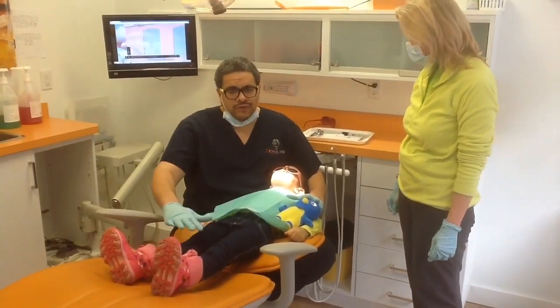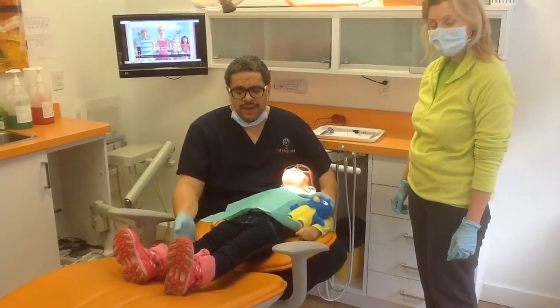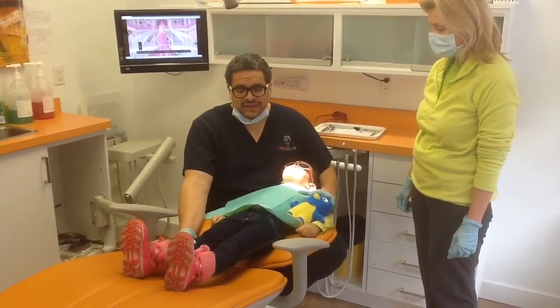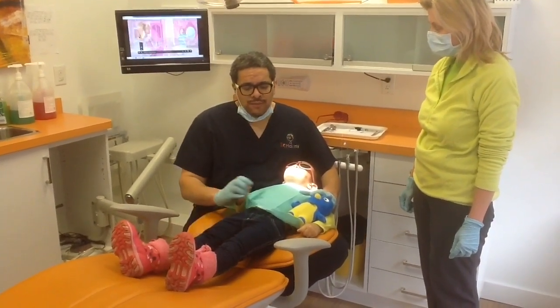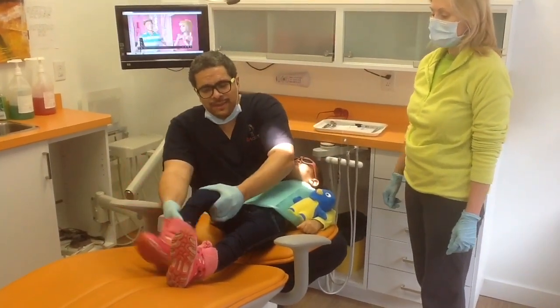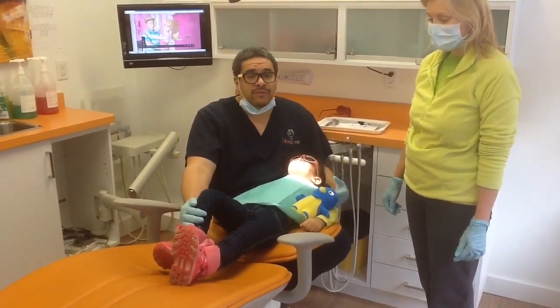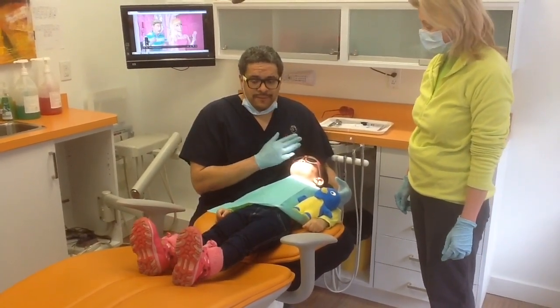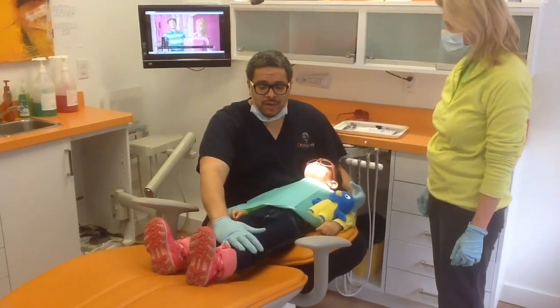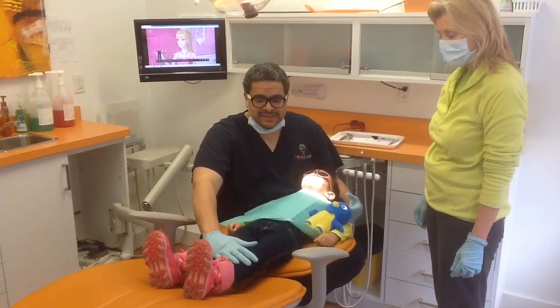One of the first things you want to do is make sure you have the patient in a comfortable position in the chair. You want the patient's legs straight and their arms on the belly button where they're comfortable. You do not want the patient's legs to be bent in any sort of way because kids can push off the chair — they get their power from their knees. Make sure they're straight, especially if somebody's assisting.